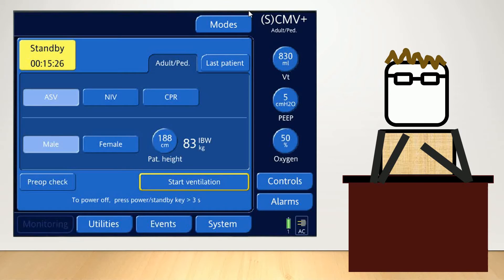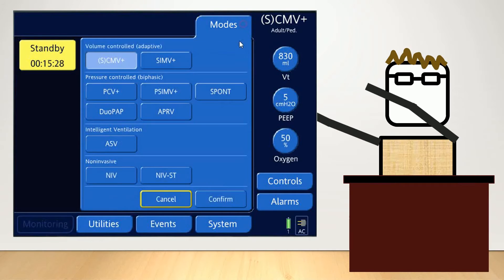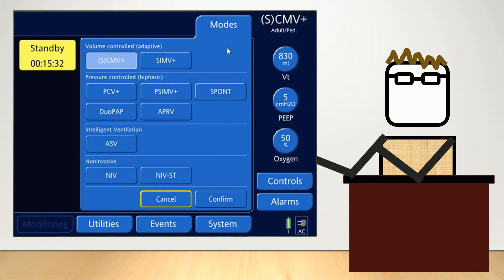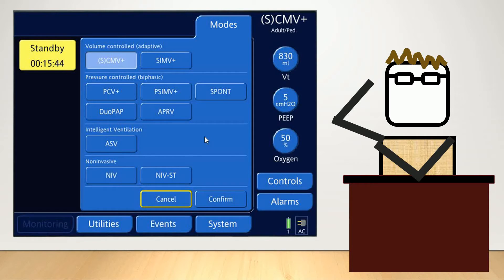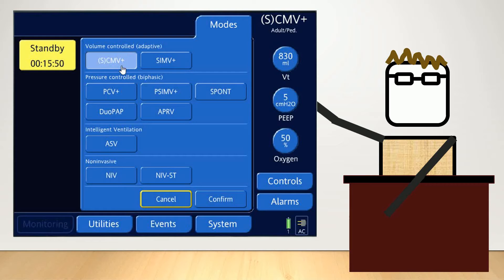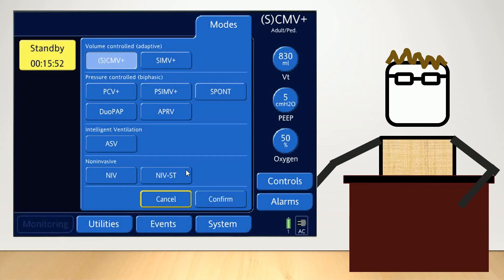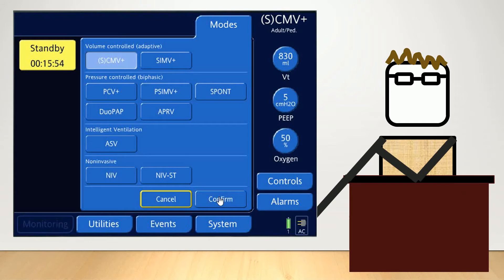So when you're using a ventilator, the first thing you need to do is choose the mode that you want to use. There are a wide variety of modes, and unfortunately most ventilator manufacturers will use different mode names, and sometimes it's a little complicated. Today, because dual mode is the most popular mode used commonly, I'm going to use a dual mode as part of the demonstration. So on this, I would select the SCMV+, which is the dual mode on this particular ventilator.